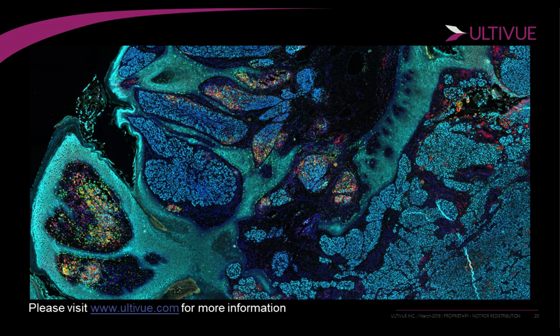And Dr. Patel, how do you deal with tissue autofluorescence? So tissue autofluorescence, that's a very good question. That's something that comes up on a very regular basis. With our assay, our signal to background is so high that you do not worry about autofluorescence.